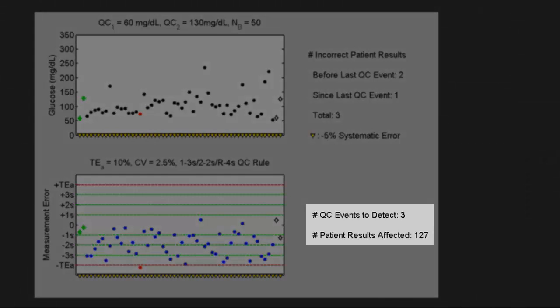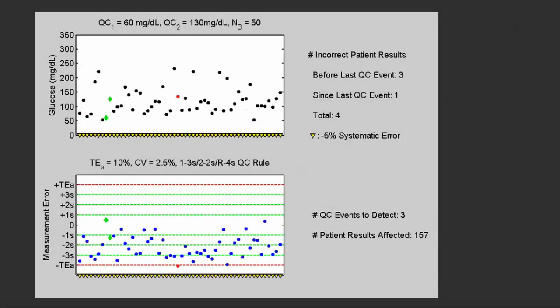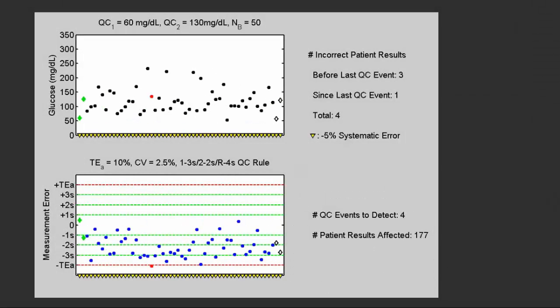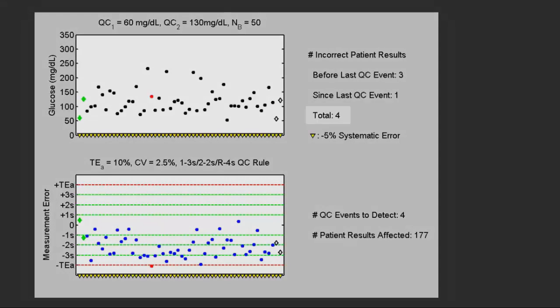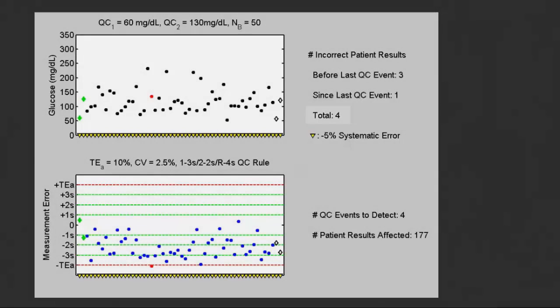So we've accepted QC three times since the five percent shift occurred and we have 127 patient results that have been affected. So we continue testing and get another acceptance and another unacceptable result. Now we have a total of four. We continue testing and get another QC rule acceptance.